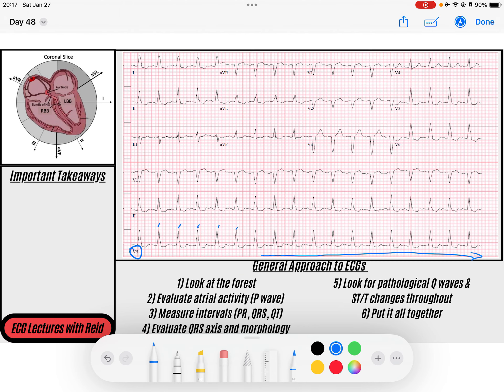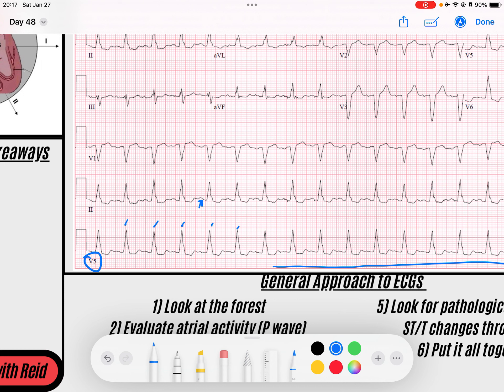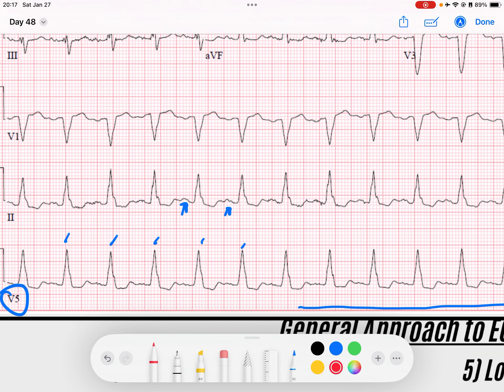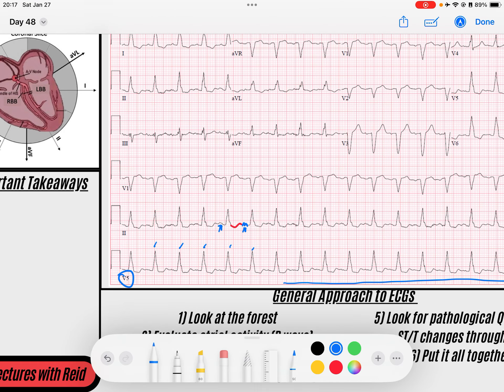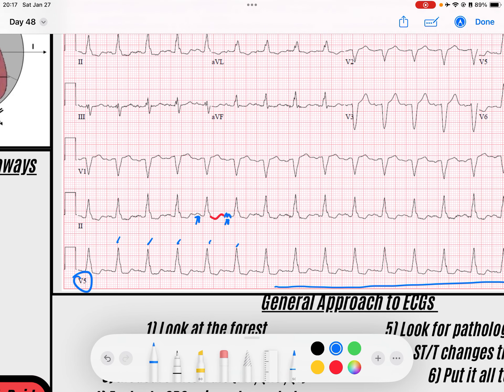I've got some P waves before my QRSs, so that's reassuring. The reason why I say these are P waves — if you look really closely, T waves are usually really smooth, and P waves are sharp deflections. That's the difference between a T and a P sometimes if you're having trouble. We'll still get the rate here. We'll find a QRS that lands on a solid line — maybe this one's pretty close. 300, 150, 100 — a little bit faster than 100 beats per minute, so maybe 110 beats per minute. Eyeball on it. So it's a tachycardia.